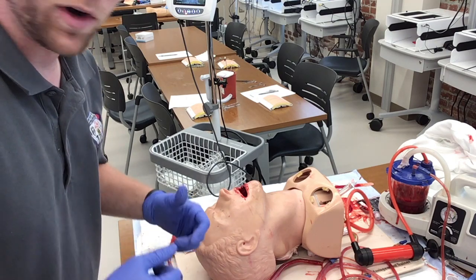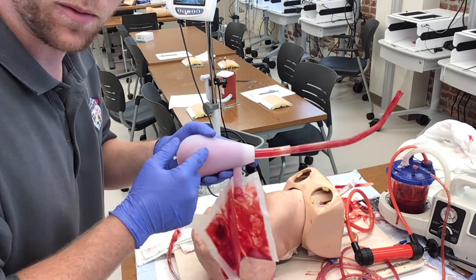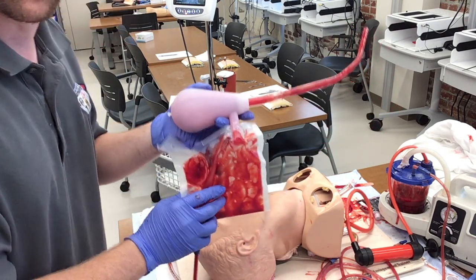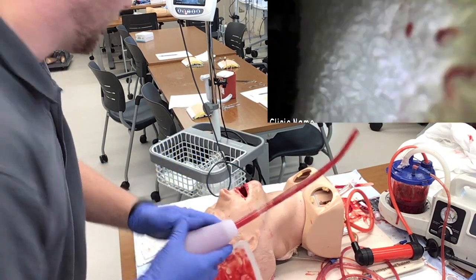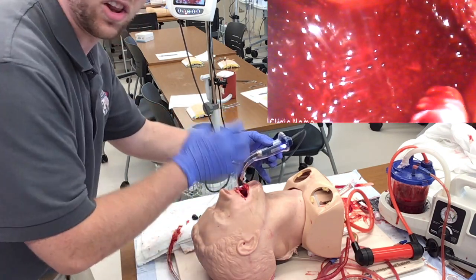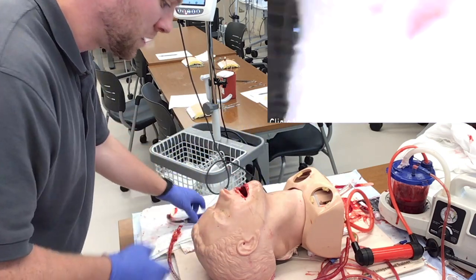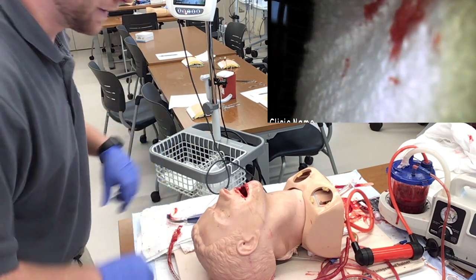Today we're going to try out the C-duck — the decanto catheter with a suction easy device. This thing is able to hold a liter worth of fluid. We have a mannequin full of traumatic clumps of blood simulated using strawberry pie, and we're going to see how the C-duck does against this bloody mess.